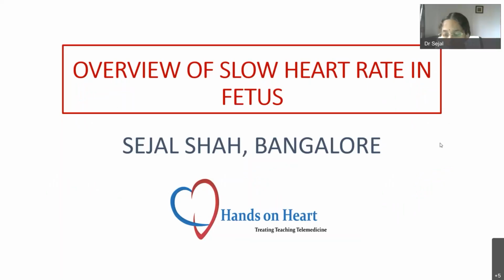Today is the fourth part of the fetal echo session and series. In the last session we discussed the fast heart rate, fetal tachycardias, and irregular heart rate. Today we will look into the slow heart rate in the fetus.